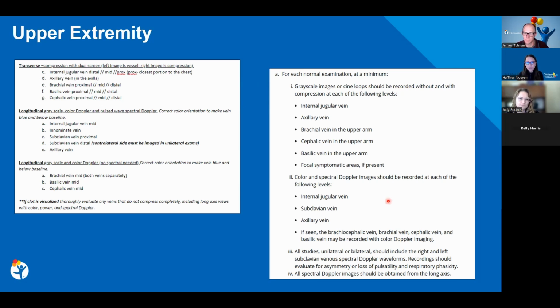Right. Yeah, because I think for access, we automatically do bilateral, but mainly central, wherever their access is. So that takes care of any questions of, oh no, we went into the wrong side or whatever, and don't have access. But yeah, just evaluating for DVTs, I'm not sure if I saw anything useful for venous.